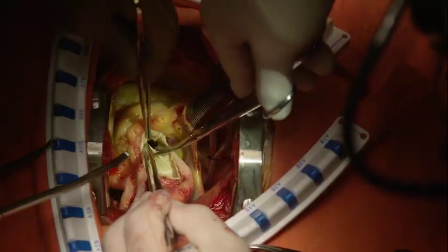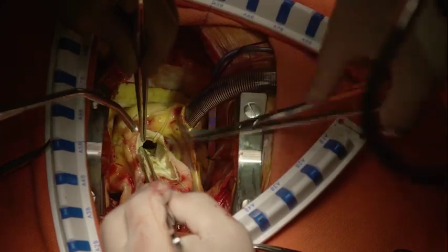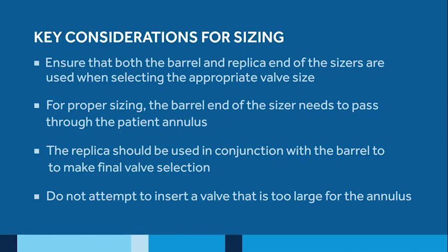Once the aortic root and annulus have been completely debrided of all calcific deposits, the annulus is sized for the appropriate Avalus valve using only Avalus sizers. Medtronic recommends that both the barrel and the replica end of the sizer be used when selecting the appropriate valve size. It is important when sizing the Avalus valve that the valve not be oversized.